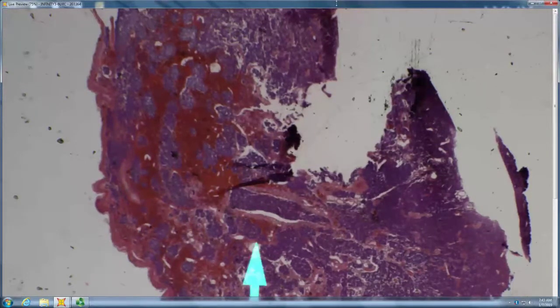It has a trabecular pattern, long parallel theques that interlace like trabecular bone. And it's smudgy blue cells, so it's likely to be a Merkel cell carcinoma, which kind of bridges between neural and epithelial.